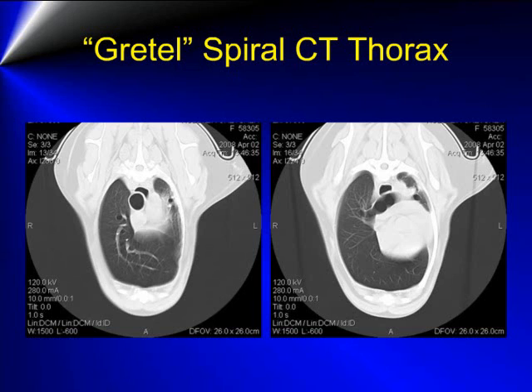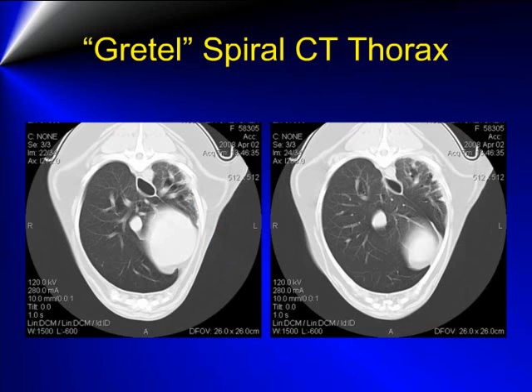The image on the right is at the level of the tracheal bifurcation, and no evidence of tracheobronchial lymphadenopathy is present. The image marked with the pink arrow shows evidence of recumbent atelectasis, which is associated with the effects of general anesthesia. The last two images are also normal and show no evidence of metastatic lung disease. Only normal pulmonary vessels and bronchi, as well as normal lung parenchyma, is seen.